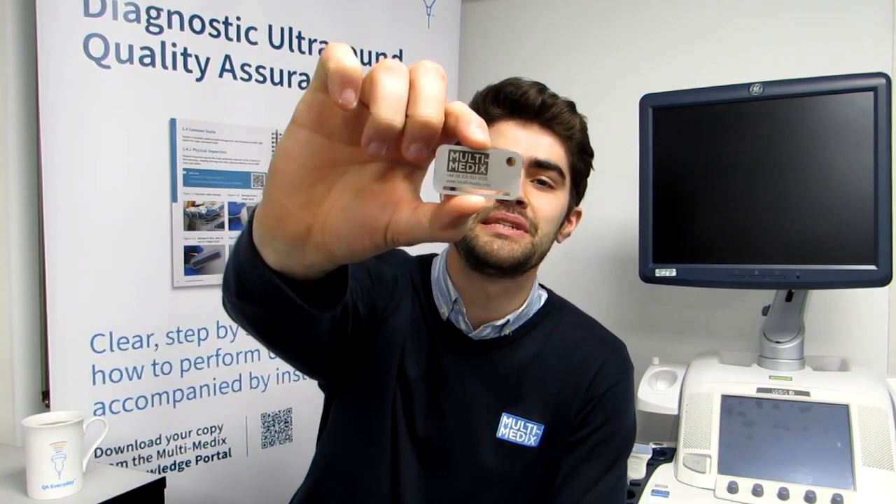Hello, I'm Dan and I'm going to do a very quick demo on how you can use a Multimedics QA test tool to perform dropout testing on your ultrasound probes.